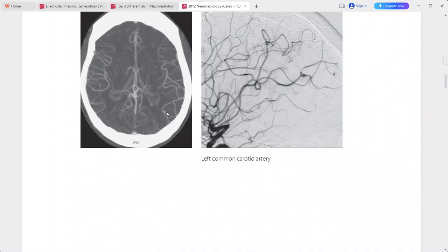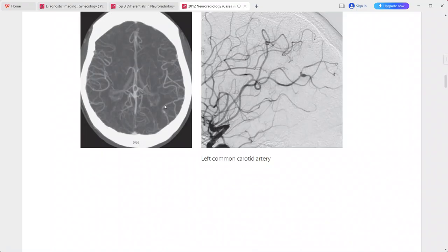CT angiogram shows a small site of aneurysmal dilatation in the distal left MCA branch. Catheter angiogram confirms a focal fusiform aneurysm in the distal MCA branch with irregular narrowing of the parent vessel. This is a case of mycotic aneurysm.